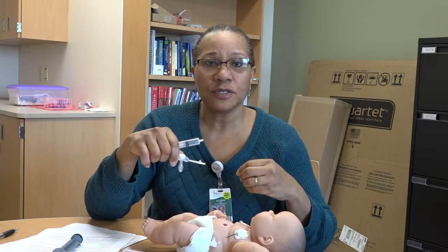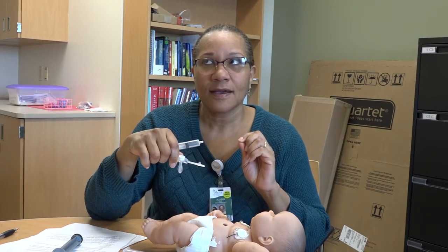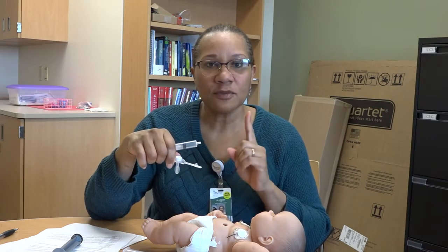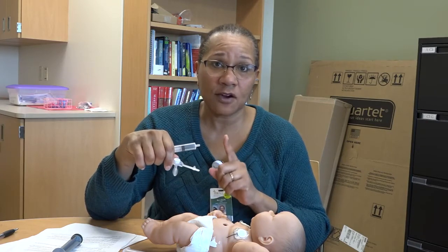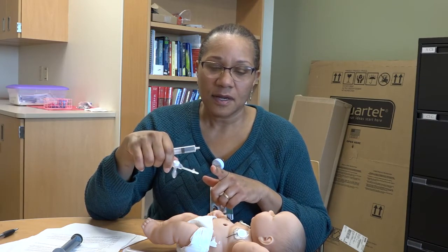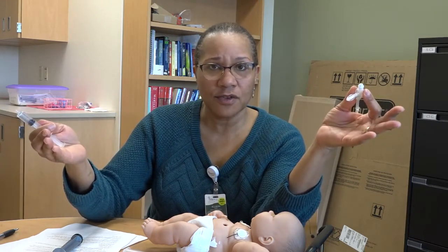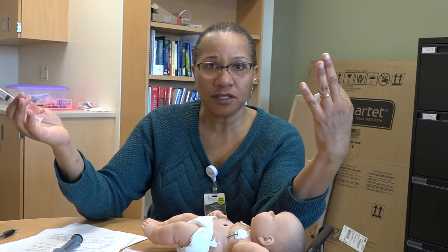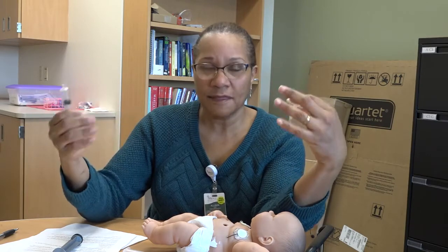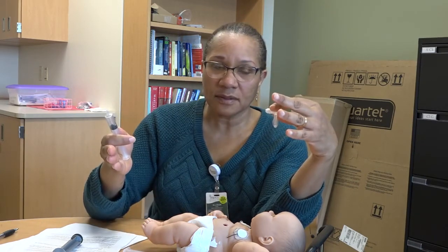This isn't anything that you would do. You would perform the volume checks after we have already made the first G-tube change, if they are necessary. Okay. So let's say you're noticing a lot more leakage than what you had before. You call the office, and you say, you know, we're seeing a lot more leakage. The first thing we're going to ask you to do at that point is to check the volume in the balloon, okay? So once again, this is after the first 3 months.